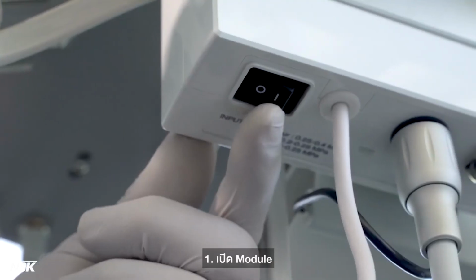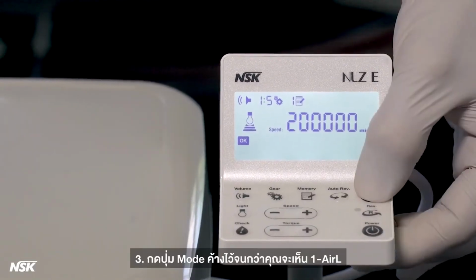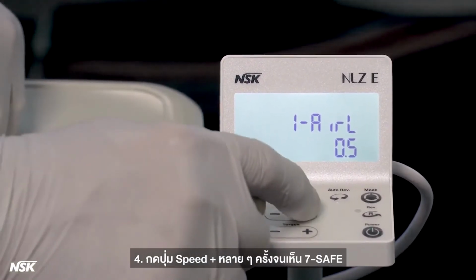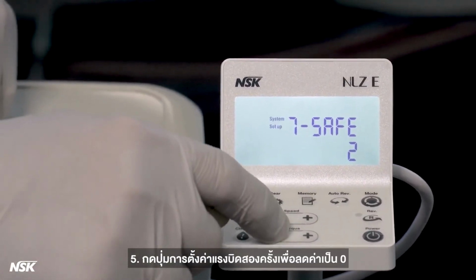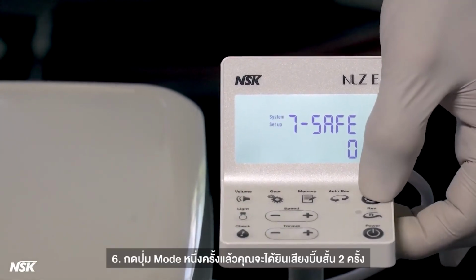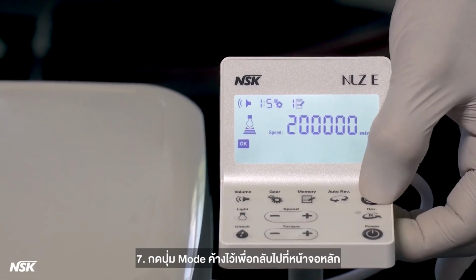How to override the initial safety functions. Turn on the module, then turn on the touch panel. Press and hold the mode button until you see 1-AIR-L. Press the speed plus button several times until you see 7-SAFE. Press the torque setting button 2 times to reduce the value to 0. Press the mode button once and you will hear 2 short beeps. Press and hold the mode button to go back to the main screen.